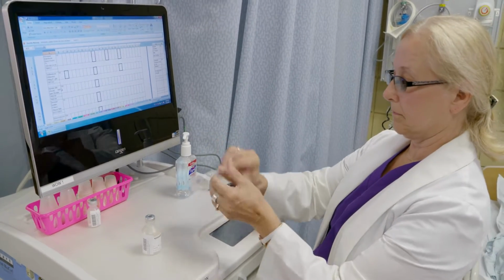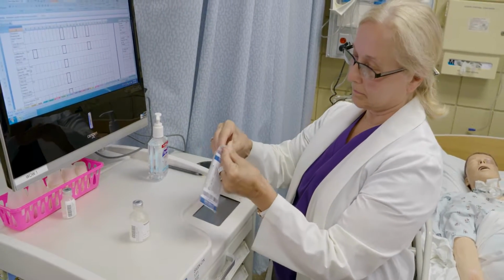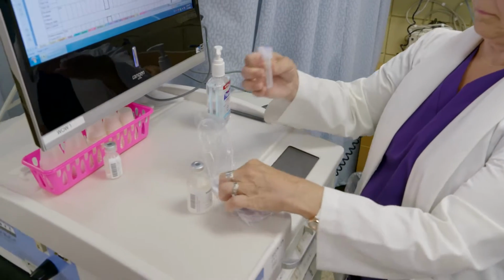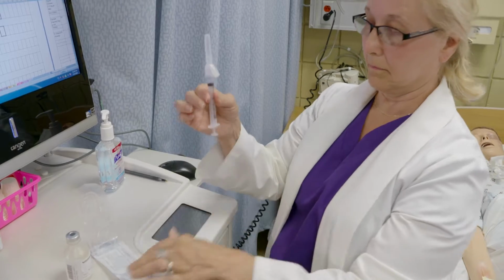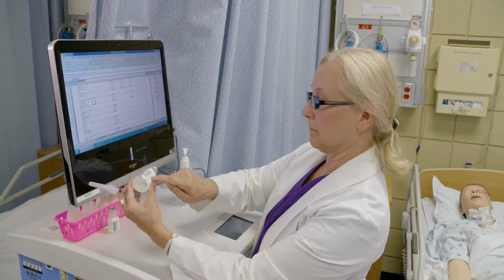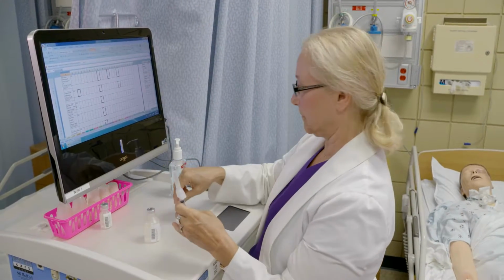Remove it from the drawer. Take the syringe out of the package. Make sure that the needle is secured to the syringe barrel. Figure out your math dosage from doctor's order to what is on the vial bottle. The order is 3,000 units. On hand is 3,000 units per ml. You will need 1 ml of medication.